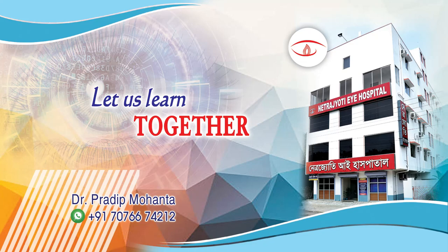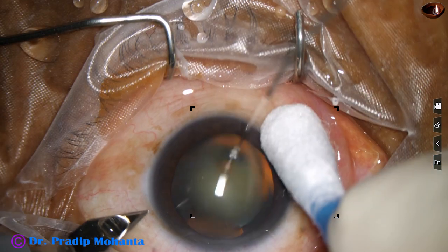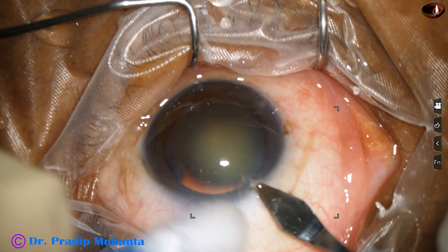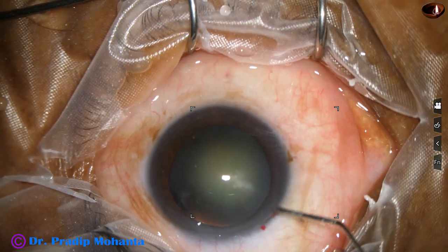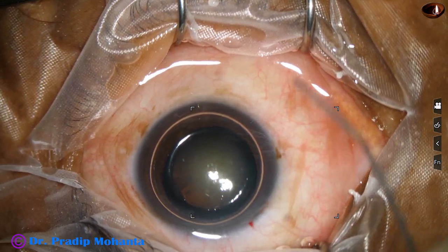Friends, welcome to my workplace for hands-on FECO and SICS training. This is a cataract with grade 3 nuclear sclerosis and there is zonular dehiscence at 2 o'clock. We will see that in a short time. This is an edited video; the surgery took about 24 minutes and has been edited to 13 minutes.